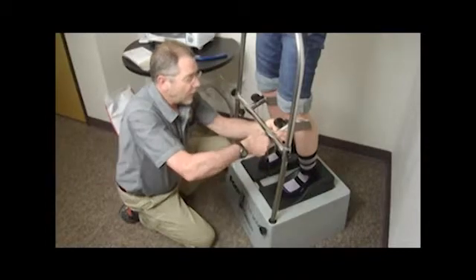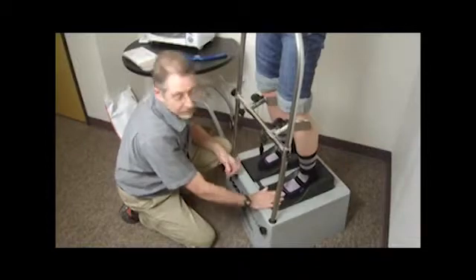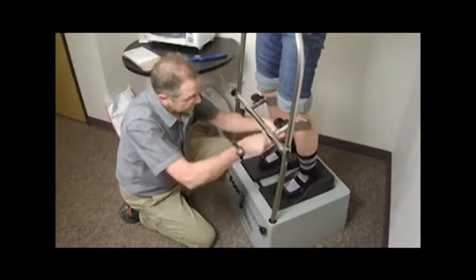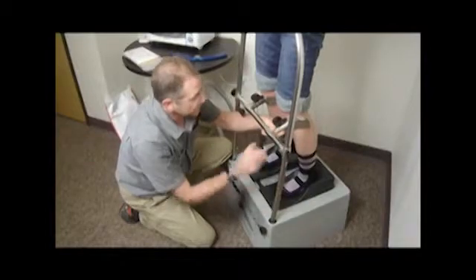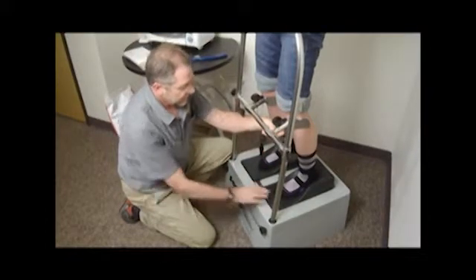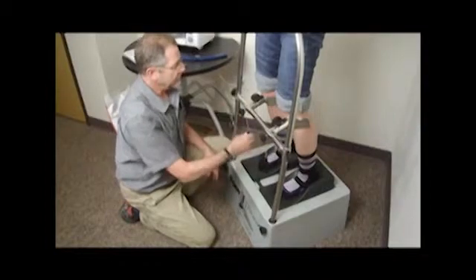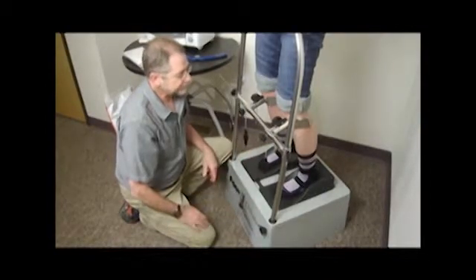There. Or, in her case, there is a leg length discrepancy, which we discovered when we did the evaluation, and that may account for this. At this point, if you want, you can change the alignment of the knee slightly, make it a little bit more balanced. I've moved the knee in maybe just a couple centimeters so that it's now aligning over the second toe bilaterally. Take the plumb bobs, wrap them up over the knobs so they're out of the way.